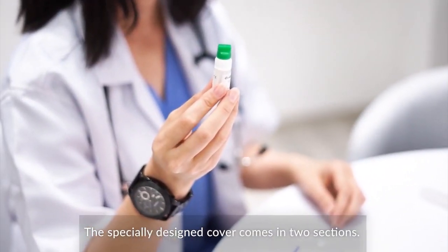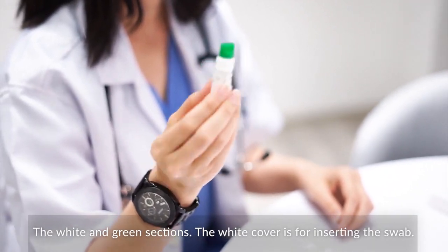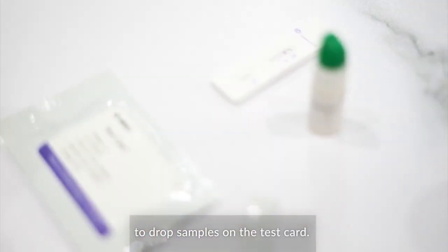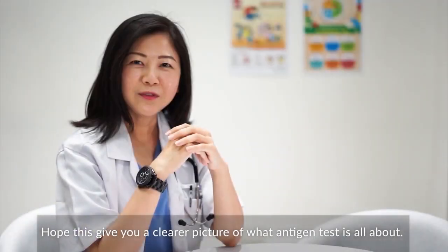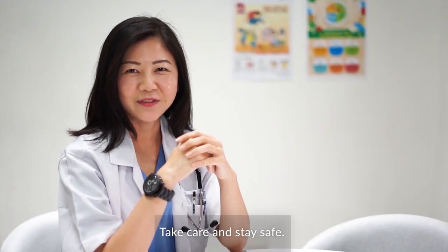The specially designed cover comes in two sections: the white and green section. The white cover is for inserting the swab, and the green section provides a dropper-like feature to drop samples on the test card. Hope this gives you a clearer picture of what antigen test is all about. Take care and stay safe.